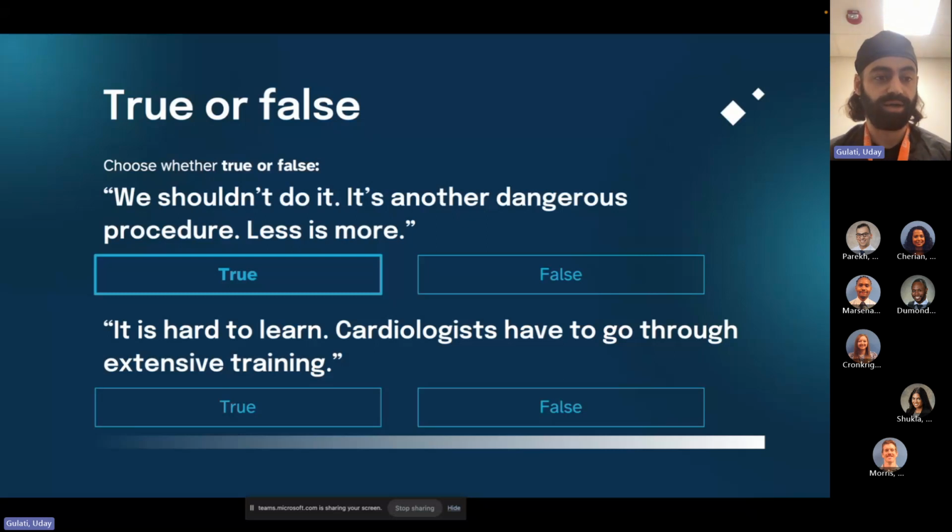And if you talk to GI fellows, they're doing endoscopy since day one with minimal complications. So we as medical doctors are likely to be as proficient at it too. And these studies have been done, right? There have been programs in the US, very commonly on the East Coast, where they teach all their fellows transesophageal echo from day one.